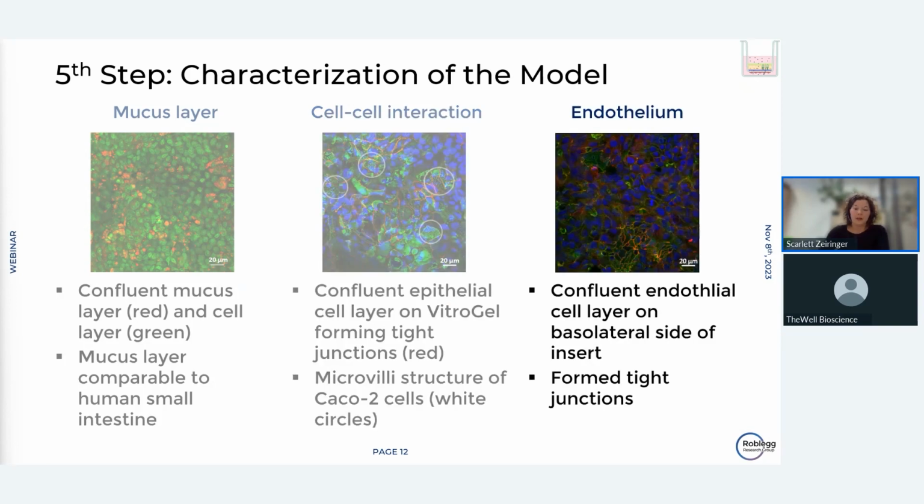The last figure depicts the endothelial cell layer on the basolateral side of an insert. The endothelial cells formed a confluent cell layer and proper tight junctions, as again indicated by the red staining.